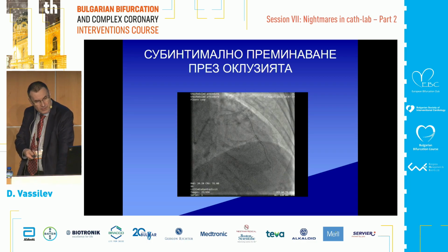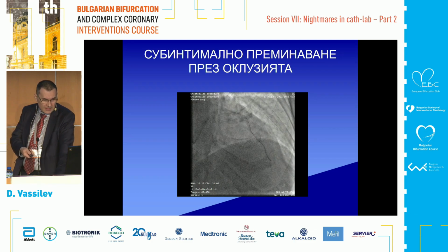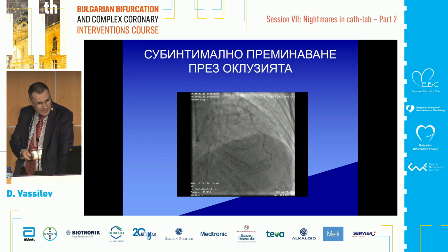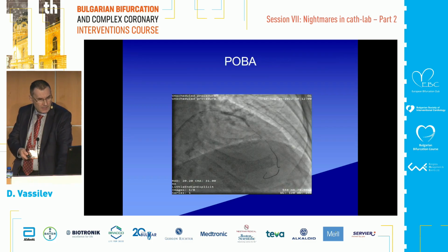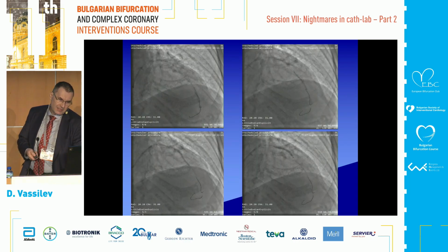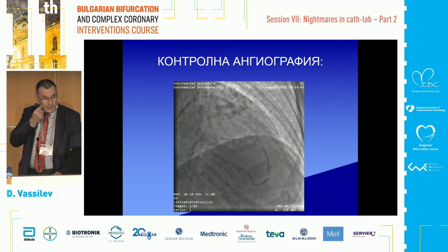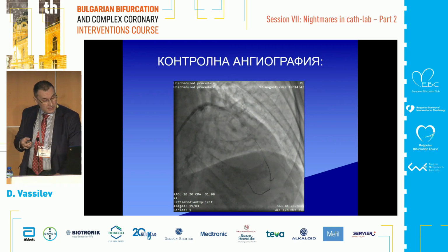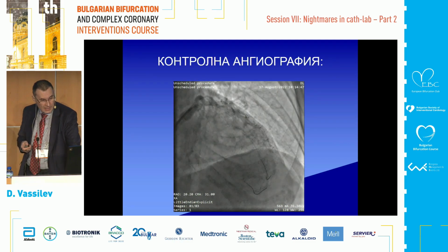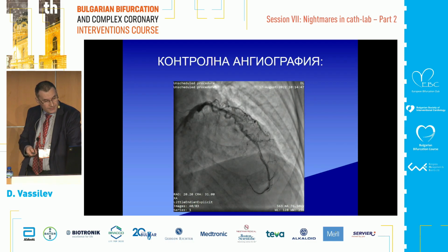Then with the Fielder XTR, we made subintimal tracking up to below the apex of the LAD. Then we made several balloon dilatations in the false lumen. And this is how the situation looks after subintimal recrossing.